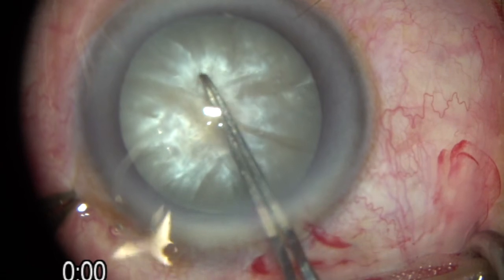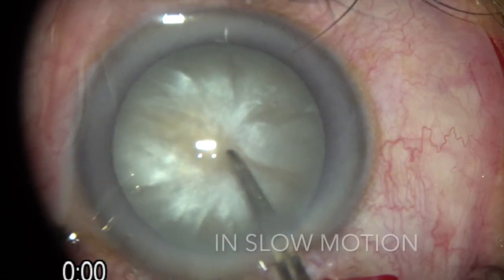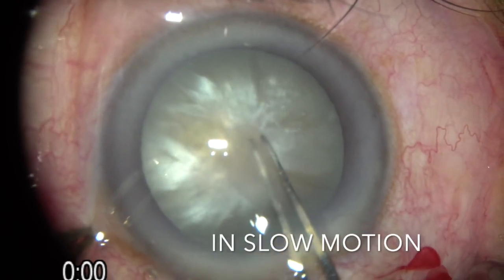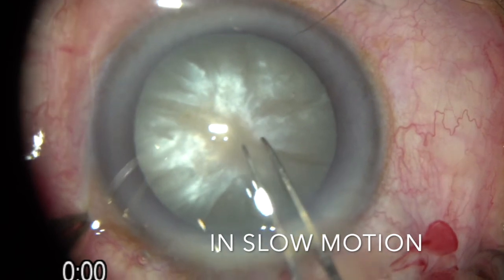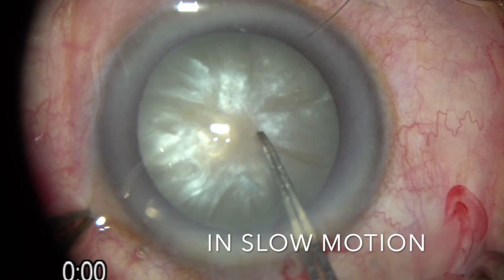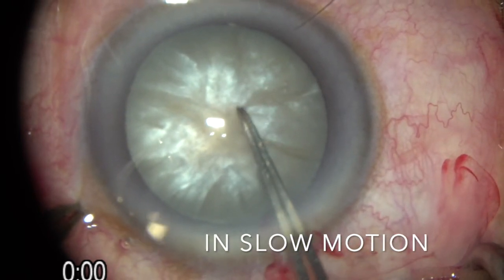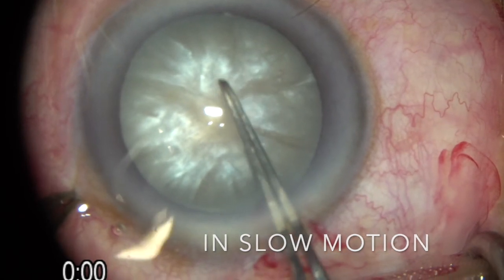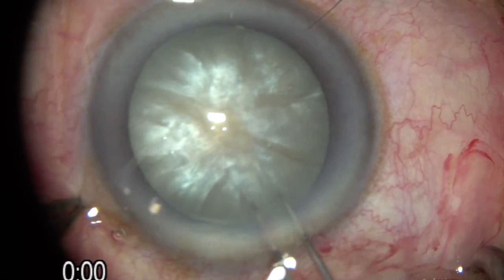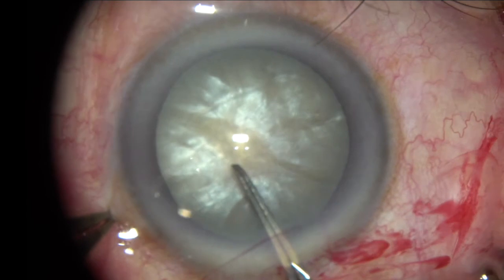In this technique, I use Utrata forceps. Cystotome cannot be used. With the Utrata forceps, pinch the center of the capsule, raise the flap and evert it. I do not usually use the dye. The movement in this case should be a light lifting movement in three-dimensional space, not using the nucleus as a support, as you would do while using a cystotome.